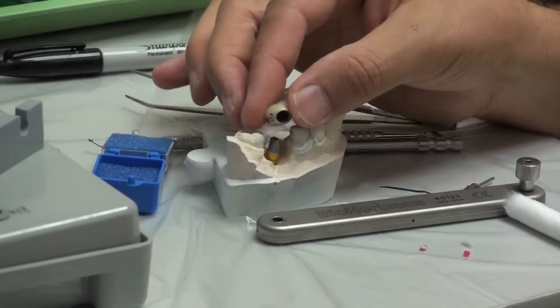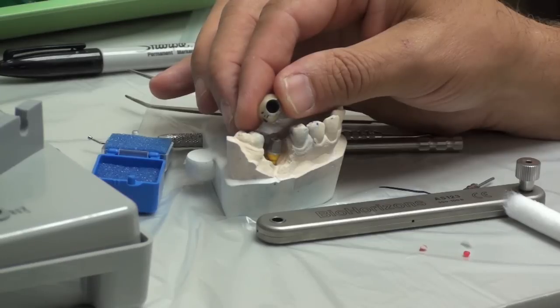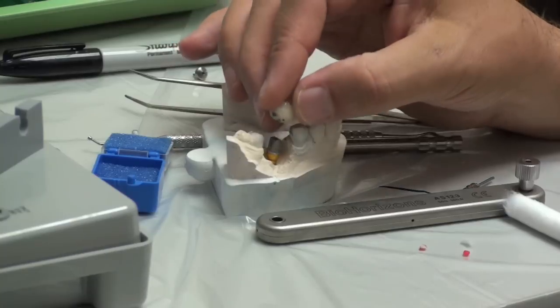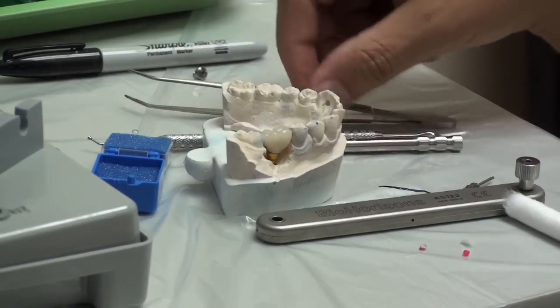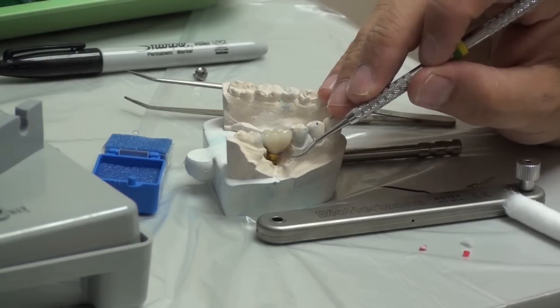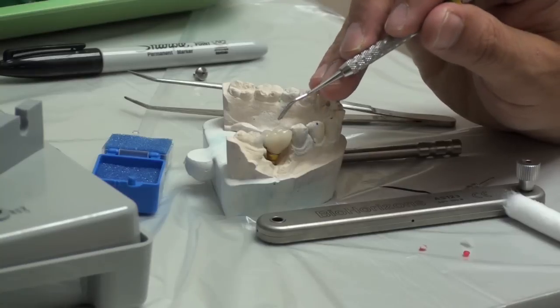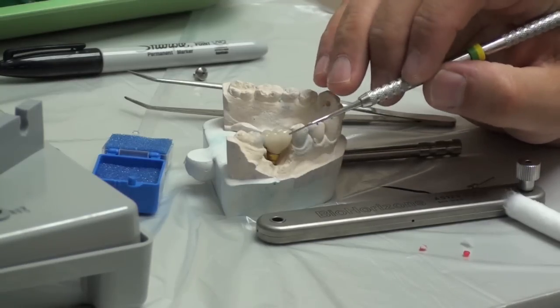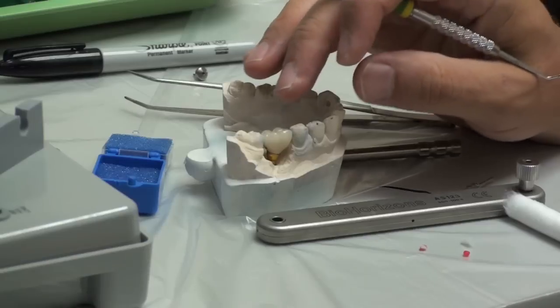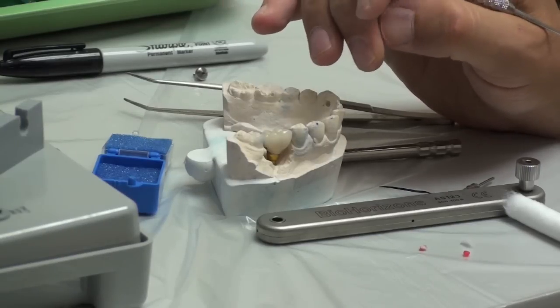We're going to cement it. When you cement a crown, you don't put as much cement as you do on a normal tooth. I'm not trying to get a perfect seal because I'm not worried about sensitivity or decay on an implant. I am worried about a huge mass of cement squishing out the bottom of the crown and getting down under the gums where it's difficult to clean out. These junctions between the abutment and the crown are sometimes further below the gum line than a typical crown on a natural tooth. So put enough cement for a light coating primarily around the margins, have the patient bite down on cotton, and do your cleanup.